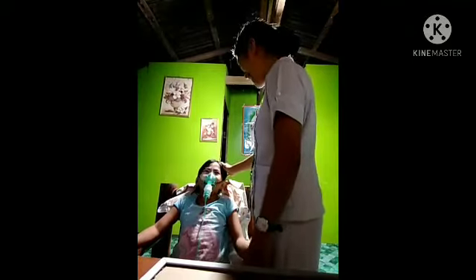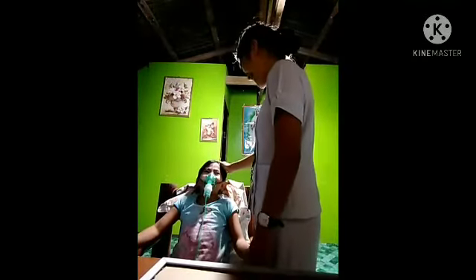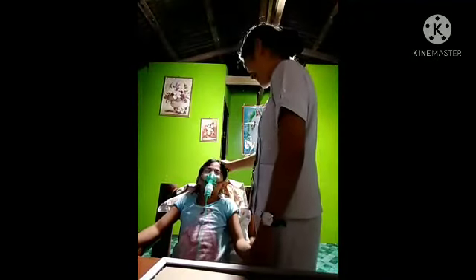Encourage the patient to expectorate, as the medication may help to loosen the bronchial secretions. Ensure that the patient is left feeling as comfortable as possible. Bronchospasm is further reduced if the patient is relaxed and reassured.